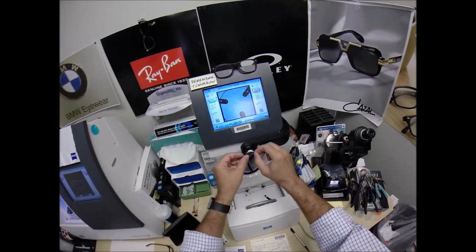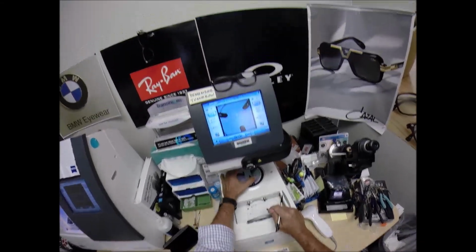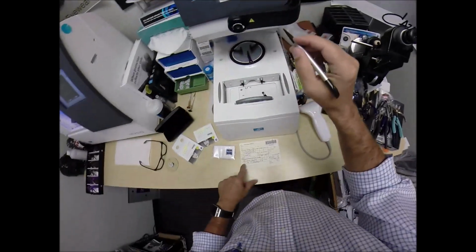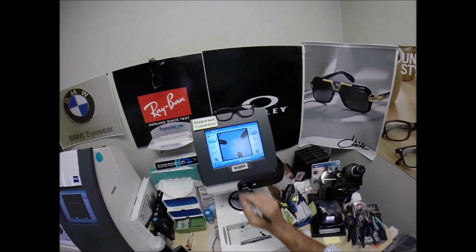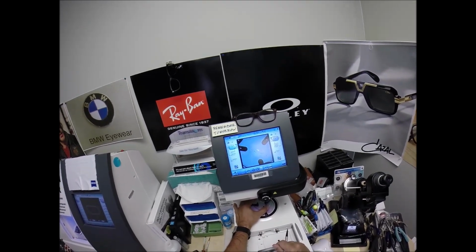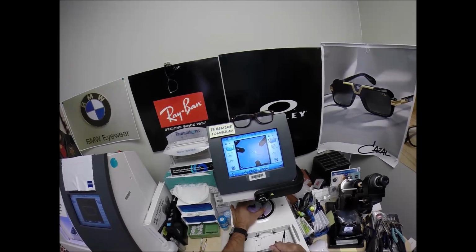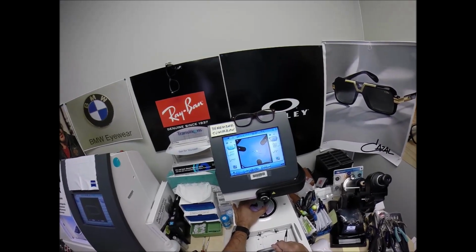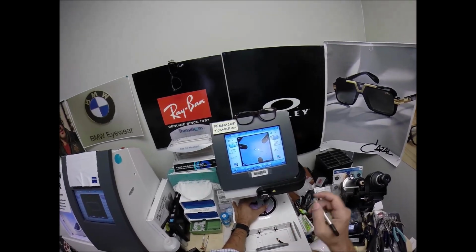Now, I've been doing Ray-Bans, Polo, Versace's, Oakley, Silhouettes, other brands for years and years. Let me change the PD to 30 on this one. I woke up one day and realized I'm a cover band. I've been putting lenses in other people's songs for years, and I decided to write my own song. And so I had to find out what song I faithfully believed in.